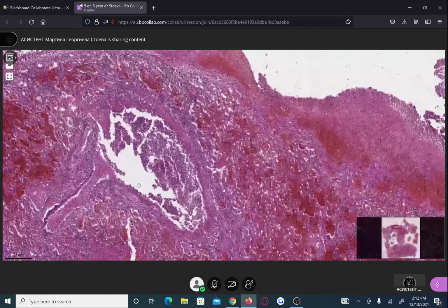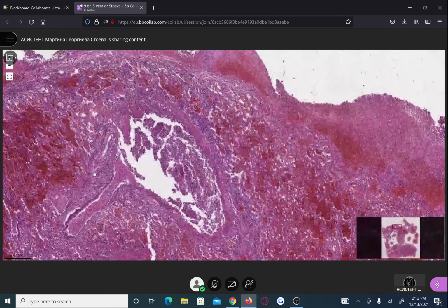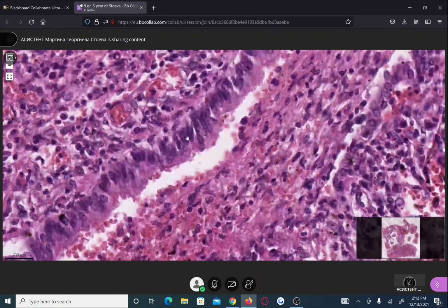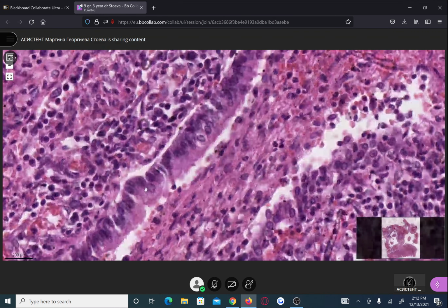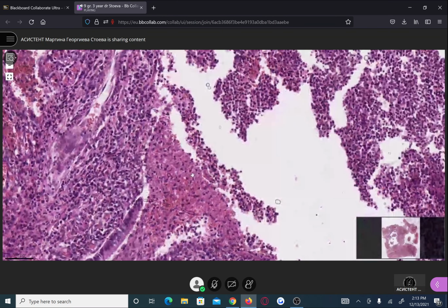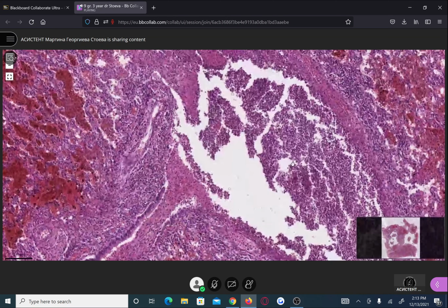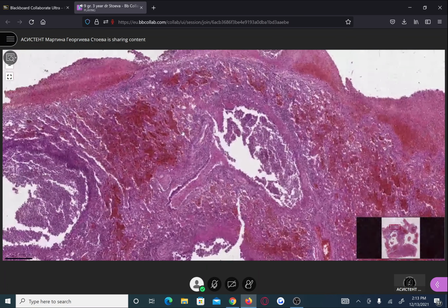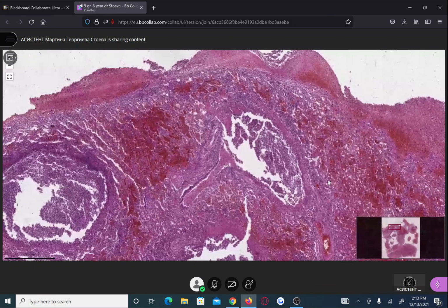Also here, now I saw that this is one bronchiole as well, and partly its epithelium is still preserved, but at the same time its lumen is highly infiltrated by inflammatory cells here as well. So the simultaneous inflammation of the bronchioles with lung parenchyma means that this is bronchopneumonia, and we can find abscesses.